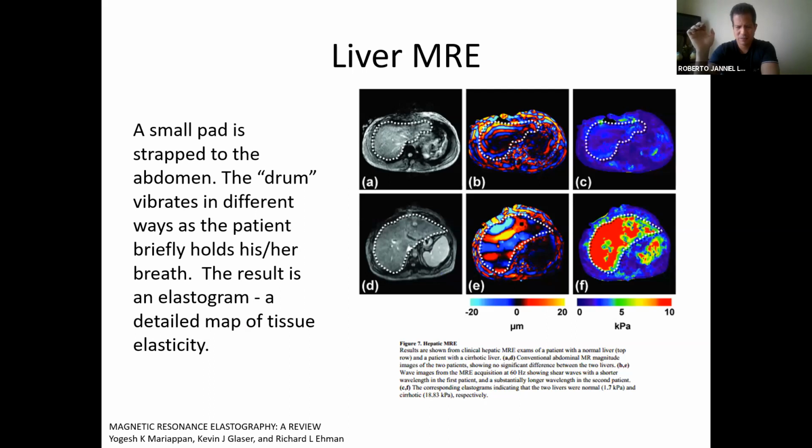And these are example images of what that would look like. The stiffer the liver, because of the higher degree of fibrosis, the higher the value for the modulus that you're going to be imaging, right? And again, here, for example, you have an image, and really compare the two. I know you can say, well, yeah, sure, it looks like there is something different in there.